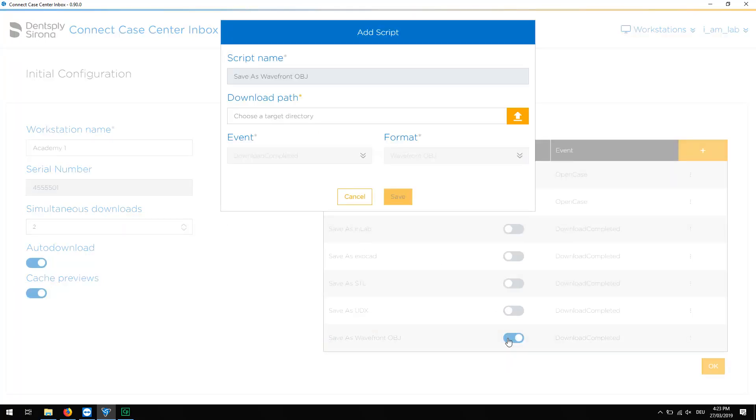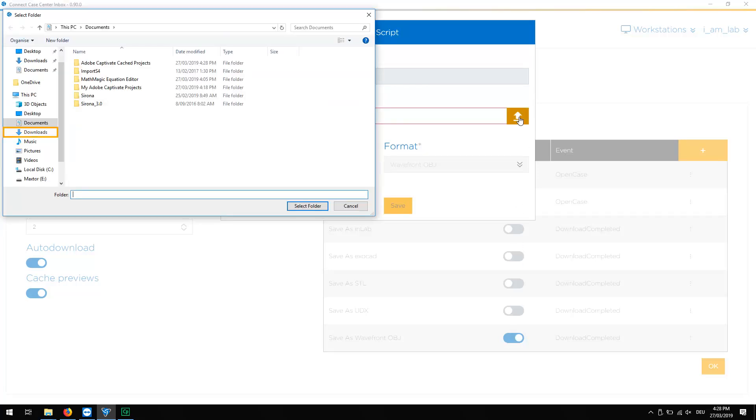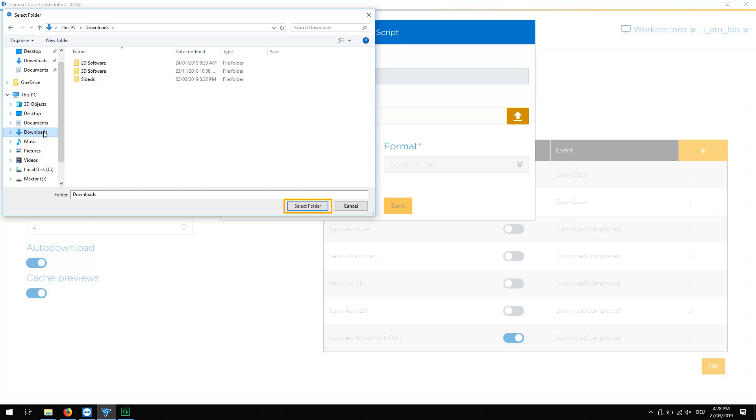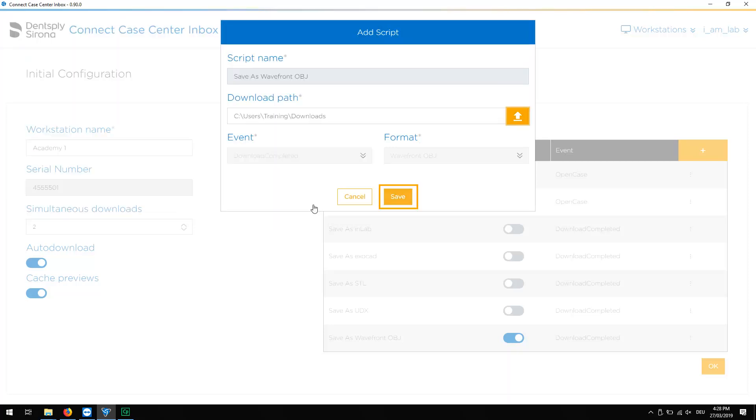A new window opens and we define the download path. By clicking Select Folder, we confirm our selection, then we click Save.